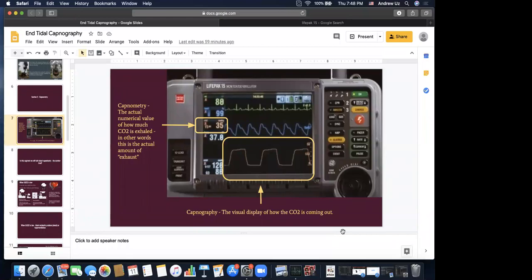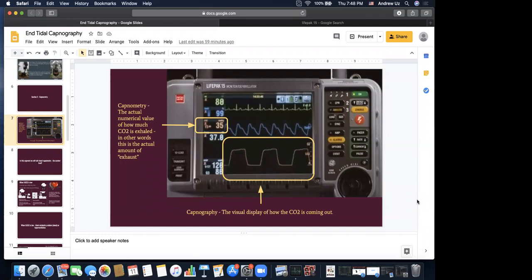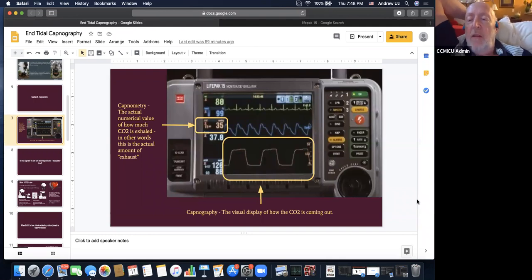Right. It actually tells you that you just got ROSC. Actually, I have a perfect example of that. I actually have a printout. If you give me 2.5 seconds, I'll show you. The first indicator of ROSC is that you see your end-tidal CO2 go through the roof. I've seen them go to 80 to 100.